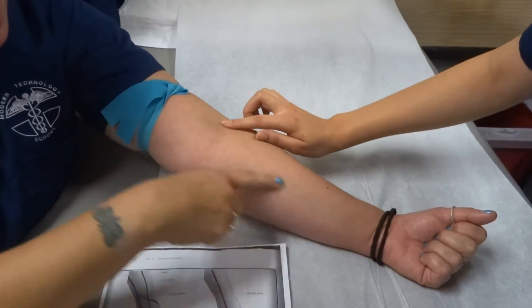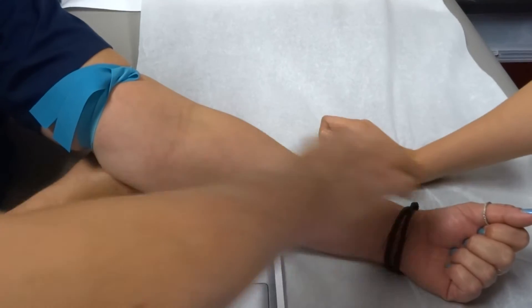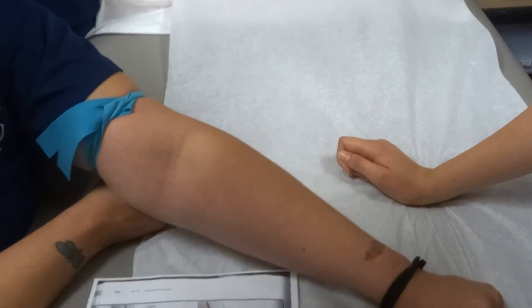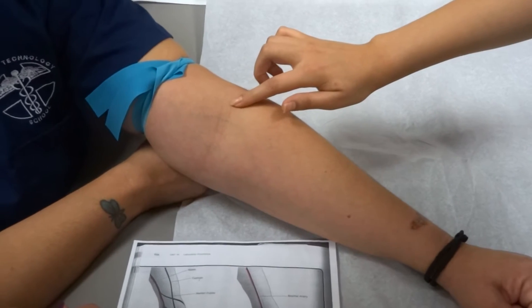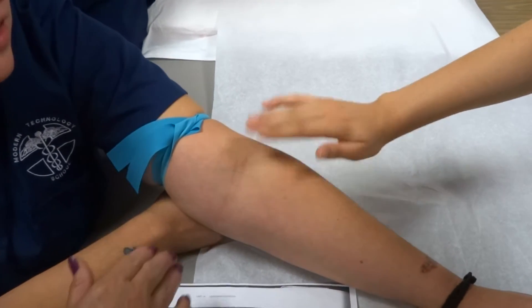I think they're all right here. Look. So this is the cephalic vein that we're looking for. If you turn your hand — keep a fist and just turn your hand — usually the cephalic will pop right about there. Can you feel anything in there? Kind of. Tap it again. Tap it a little harder.